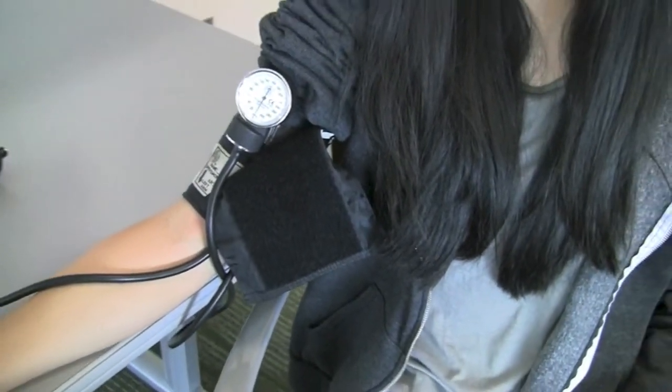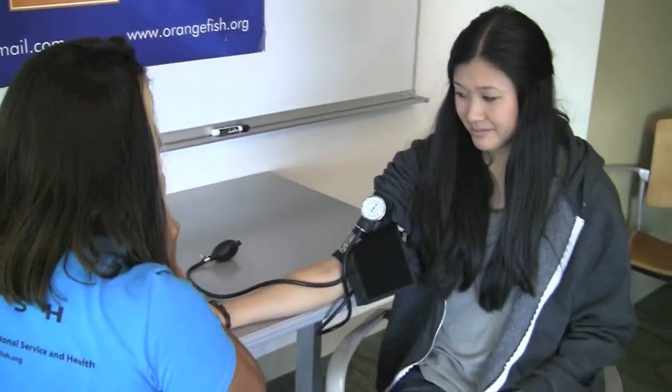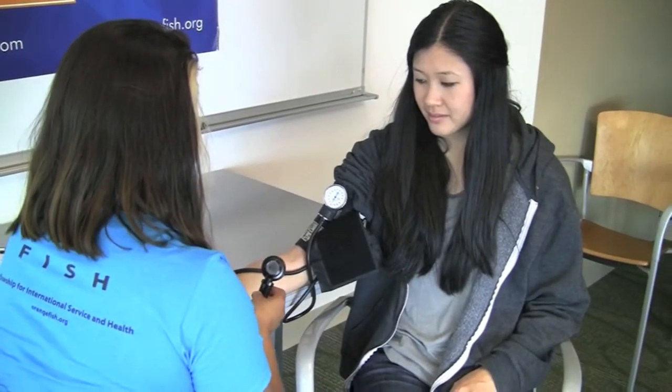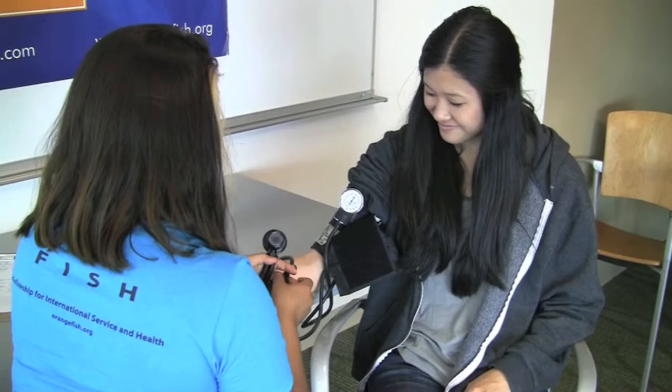Place the stethoscope in your ears and make sure that the ear pieces are pointing forward. Place the stethoscope in the crease of the arm over the brachial artery, where you felt the strongest pulse.